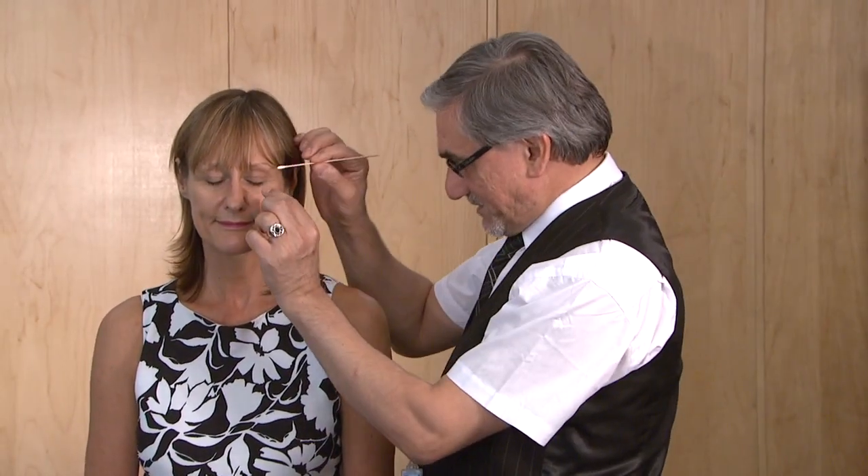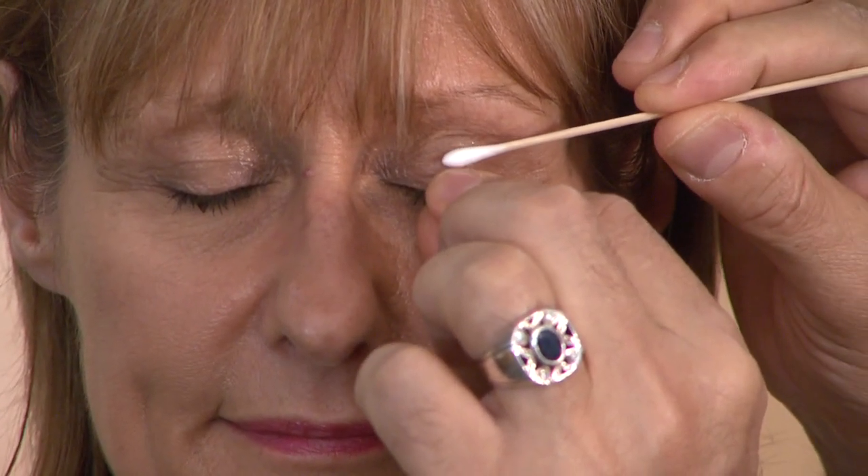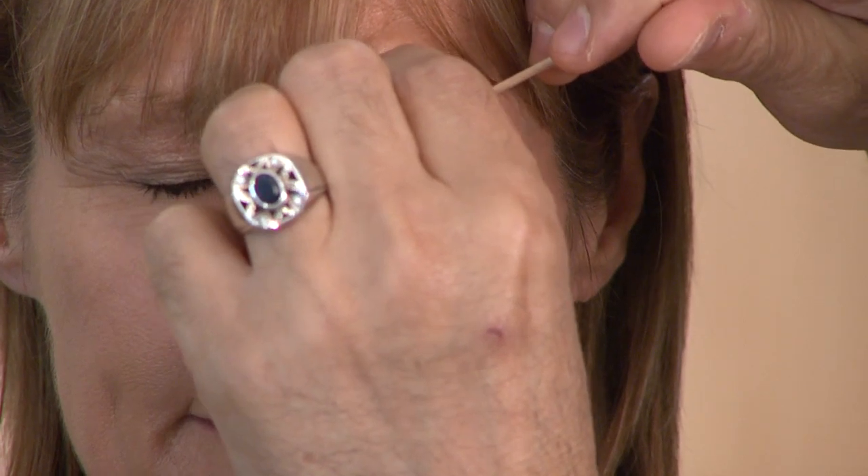Finally, to evert the lid — ask the patient to look down. It's slightly uncomfortable so warn the patient. Pull the lashes as well as the lid margin, because if you only pull the lashes you may pull them out. Ask the patient to relax, then press the cotton bud on the lid and push it back — that will evert the lid. You can then see behind the lid: if there's a foreign body you can remove it with the cotton bud; if there is congestion, follicles, or concretions, you can see those too. Gently put the lid back. The trick is to pull the lashes and lid margin, press with the cotton bud, and push it back.